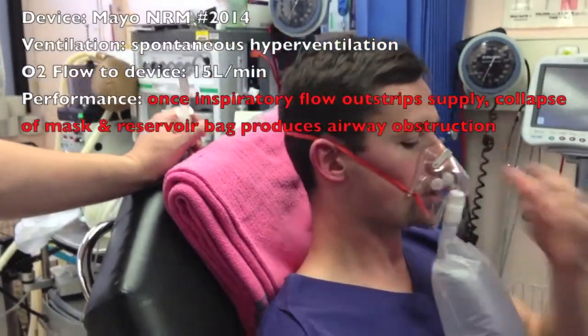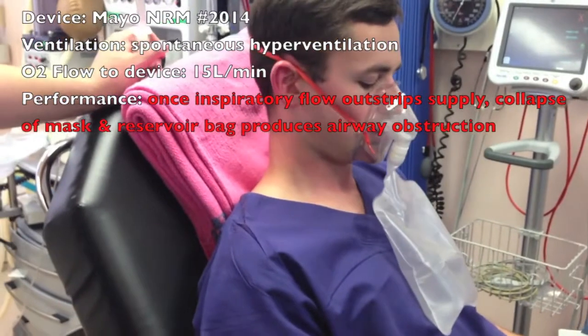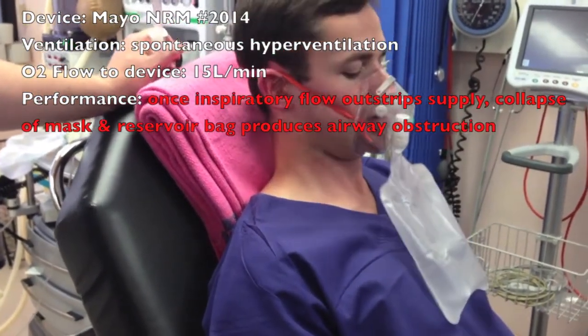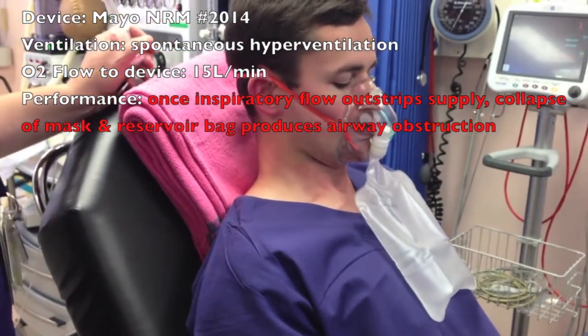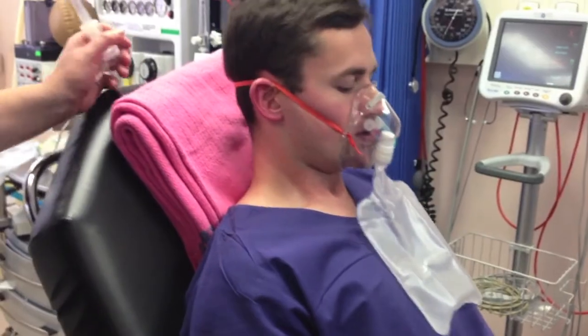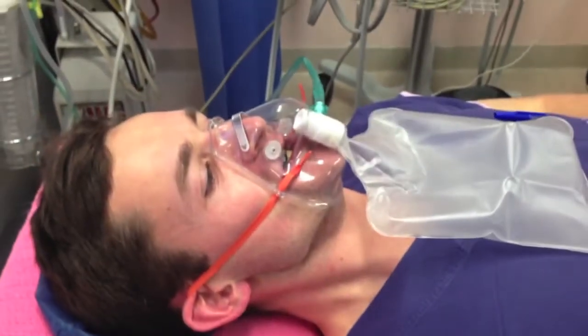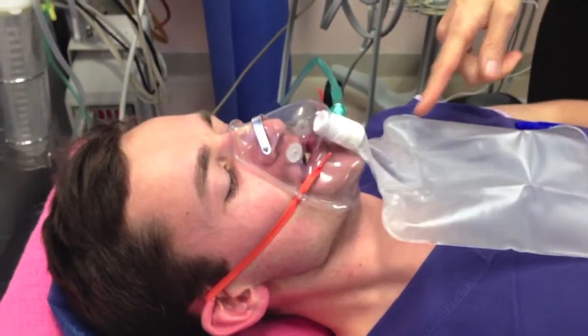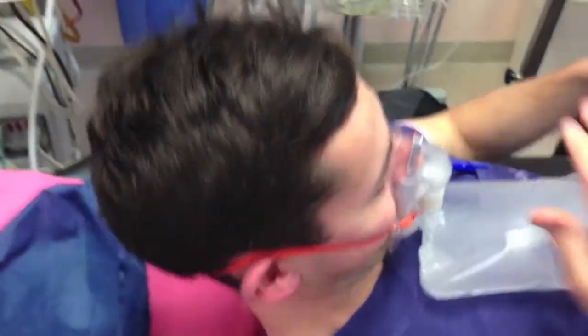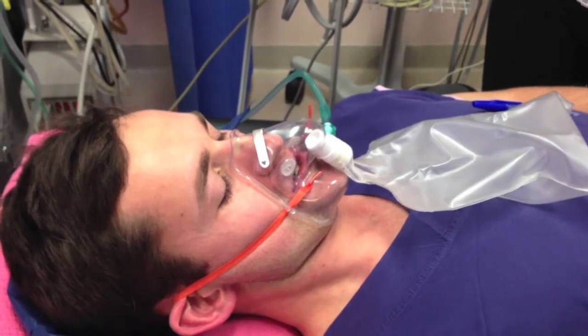To determine whether this phenomenon was being contributed to by the supine posture of our subject, we repeated the demonstration with the subject in the upright position and observed the same result. This was an unexpected occurrence, and whilst it required vigorous hyperventilation to produce sufficient inspiratory flow to cause this phenomenon, it represents a potential concern which could limit oxygen delivery via this device to severely dyspneic patients.